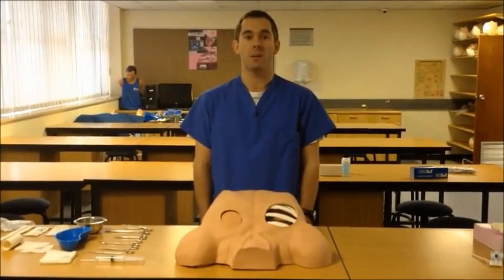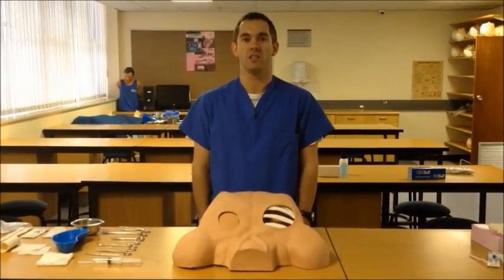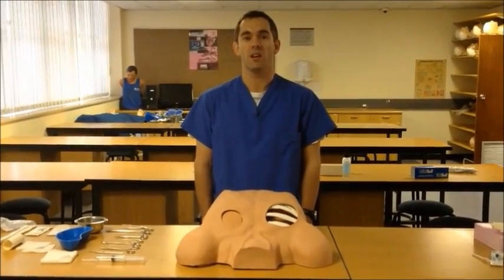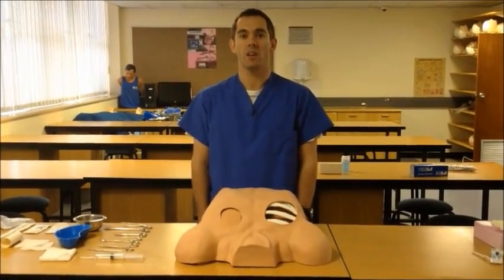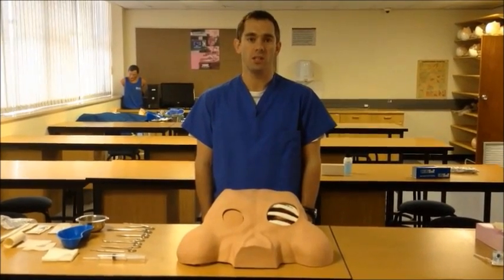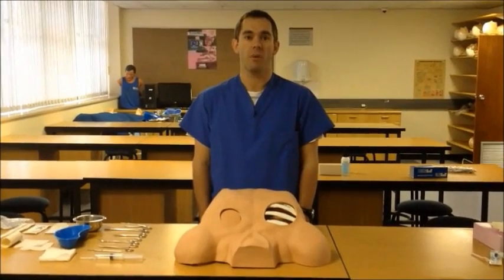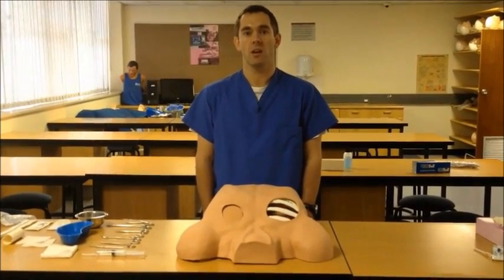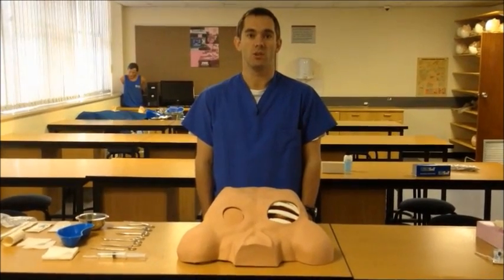Hi, this is Almiruk from Cape Town Emergency Medicine, here today to talk about insertion of an intercostal drain. Insertion of an intercostal drain is an emergency procedure to decompress the hemithorax of air, blood, or any other fluid. Although this is an emergency procedure, care should be taken for proper preparation of the patient, proper analgesia, correct use of equipment, and using the correct technique to insert the tube.